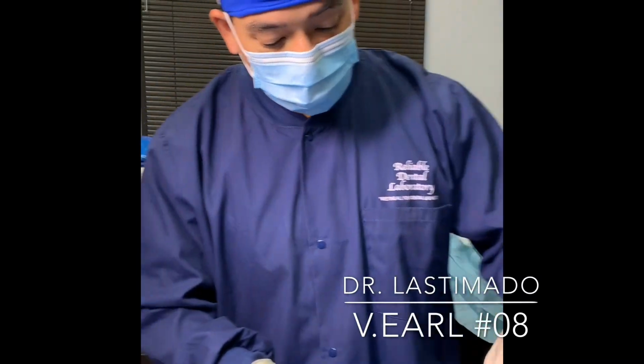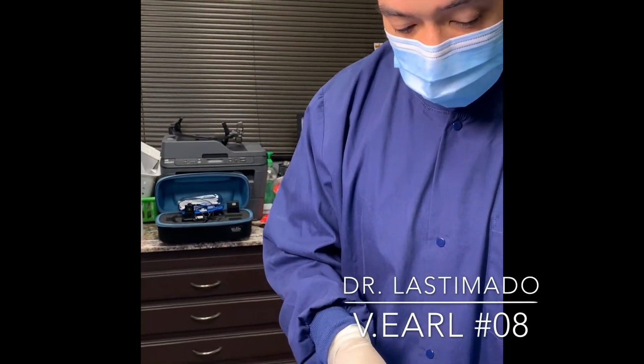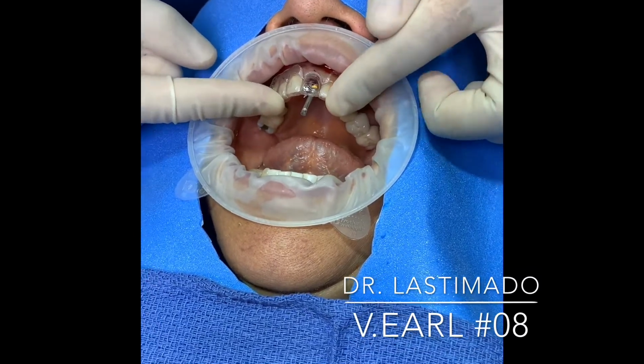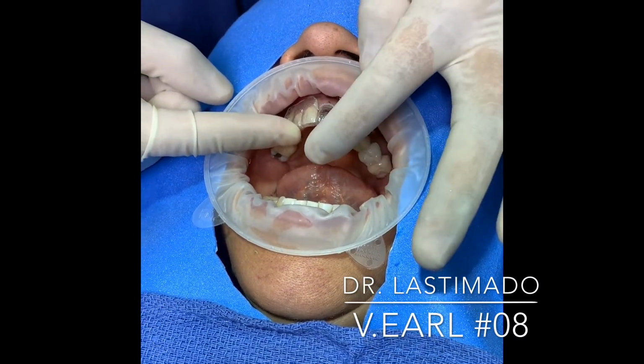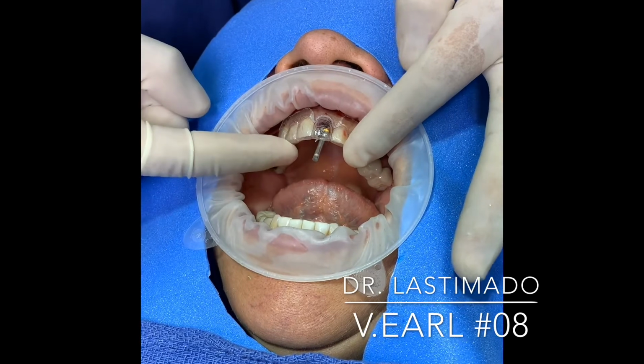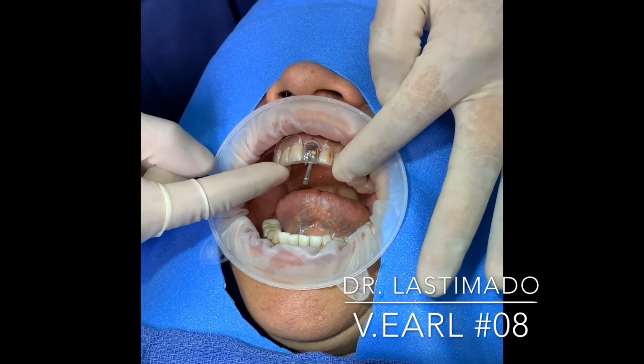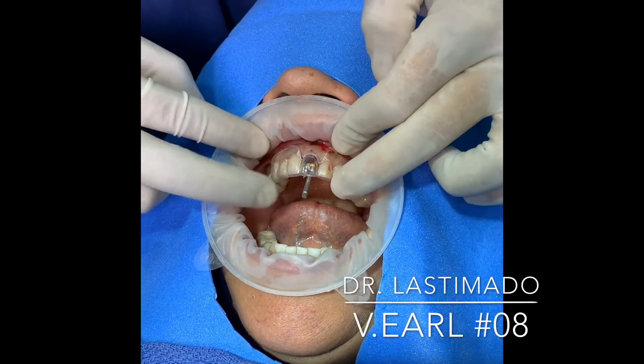So this allows us, as you can see, we'll come here to verify as we were drilling, and this snaps right in. This is a proposal of the final restoration. This is where the screw access hole will be coming out, because now what's coming up next is that's where our implant's gonna go in. So this is a really nice, quick chairside technique.